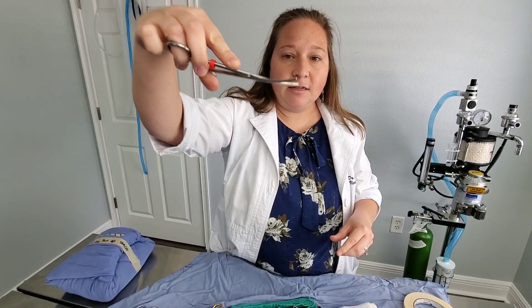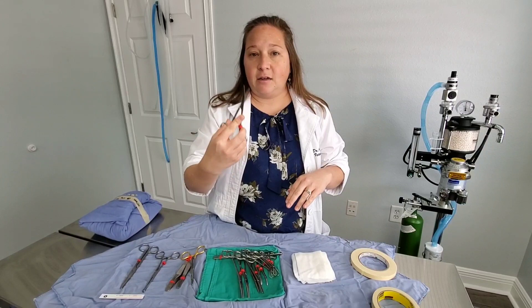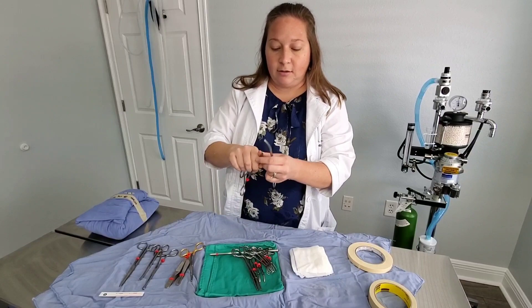These are Metzenbaum scissors. They make curved and straight Metzenbaums — these are curved and nice and small for my little hands. I love Metzenbaum scissors. These are used to cut tissue and extend incision lines. Anytime I go under the skin and I'm trying to get down to the body wall, we use the Metzenbaums to get some of the fat out of the way. It's also really important for them to be very sharp so they cause less tissue trauma.